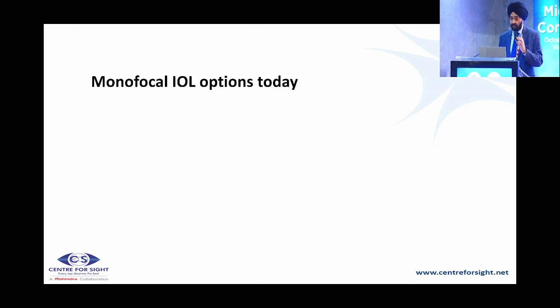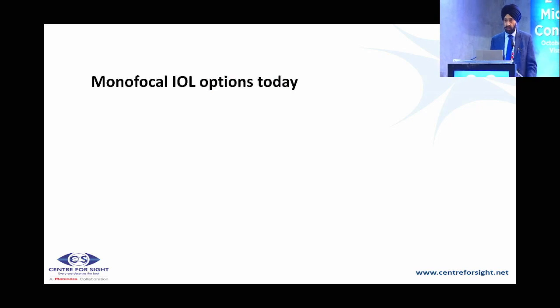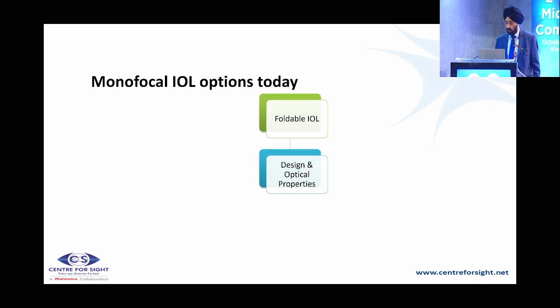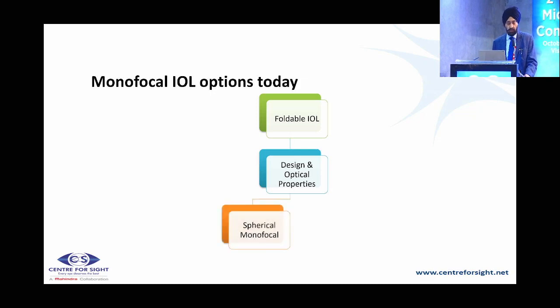So basically, when you look at today from a monofocal IOL perspective, things have changed. We had the non-foldable lenses, then came the foldable IOLs. Obviously today the foldable IOL is the standard of care because your incision is small, but still in SICS people use the non-foldable. And then among the foldable IOLs, the design and the optical properties have improved.